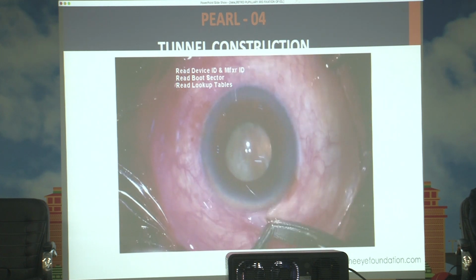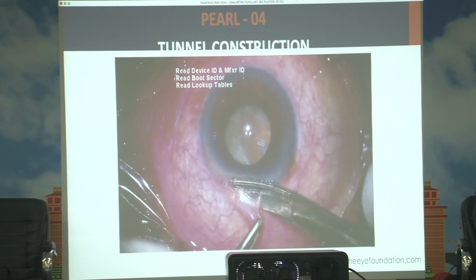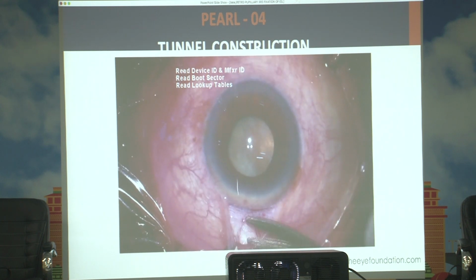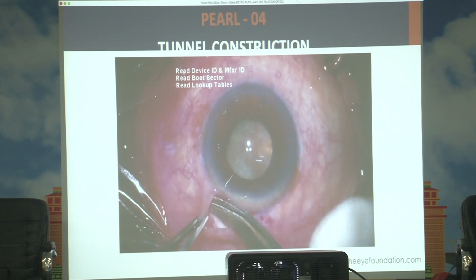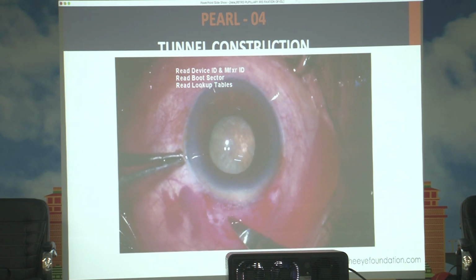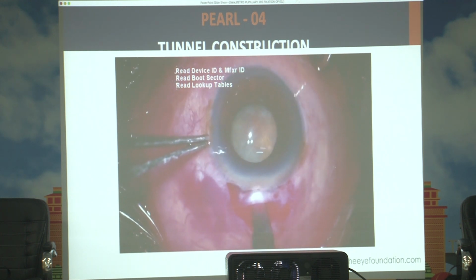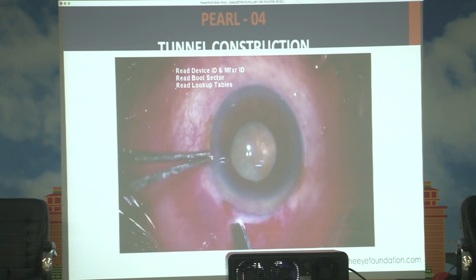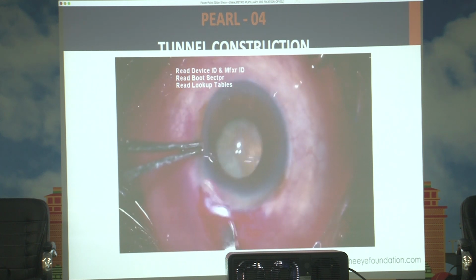Now, as far as the basic surgery is concerned, essentially you make your conjunctival peritomy, and supposing it's a situation like this, a very subluxated cataract, then it's best to make a scleral tunnel and not enlarge the corneal incision, because from a 2.4 you would have to enlarge it to insert a 5 mm optic of the IOL. You would not make a superior tunnel if you think this patient might need glaucoma surgery later. You should make a thick enough flap, but not too thick that you have a premature entry, or not too thin that you have a buttonholing.